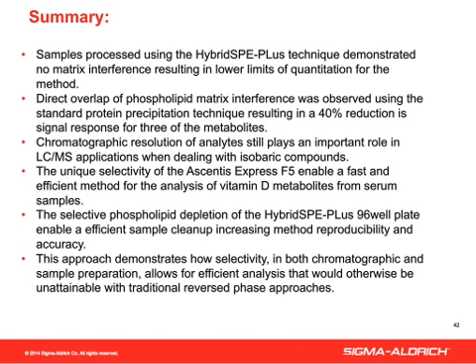I think the real message to take home is that, with the advent of mass spectrometers, we've gotten the specificity and the instrumentation, but there still is need for chromatographic resolution of analytes. And I think the vitamin D metabolite application is an excellent example of that, where it's still necessary to chromatographically resolve isobaric compounds that would otherwise not be able to be resolved on the mass spectrometer. So I think this is a good combination of showing how selectivity, both in the sample preparation along with chromatography, adds to the benefit of the assay for LC-MS.